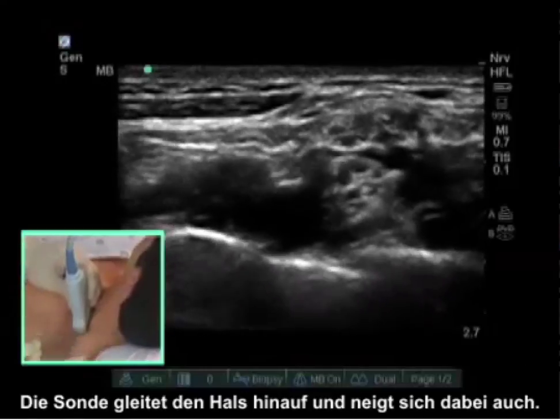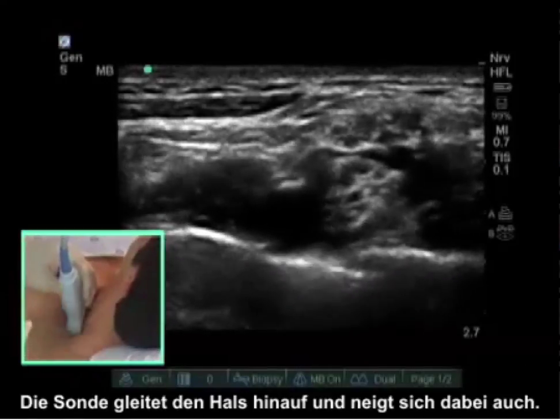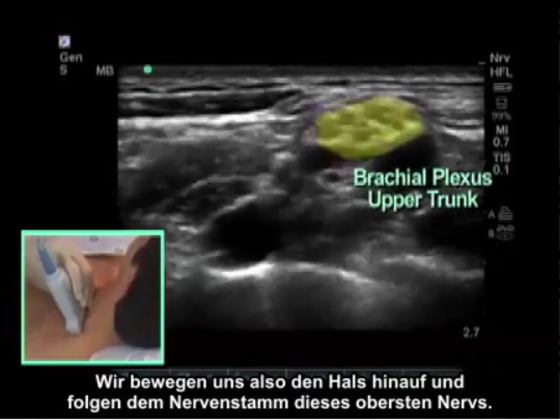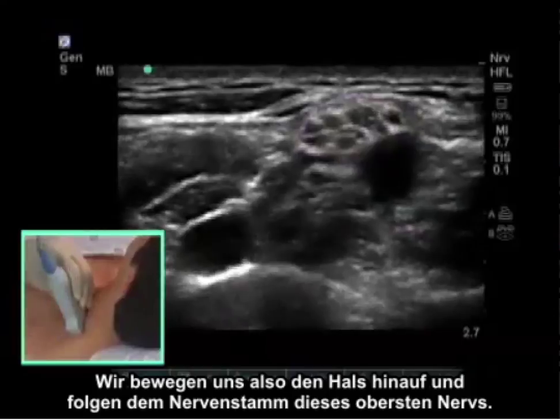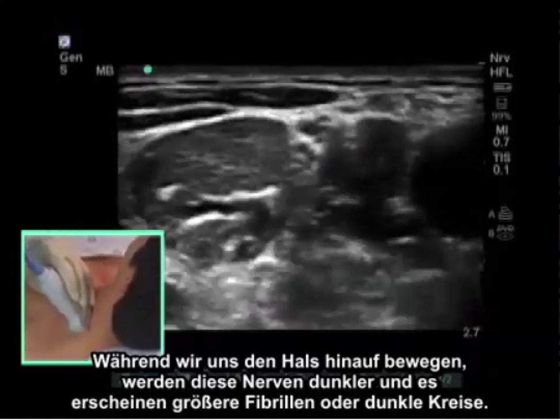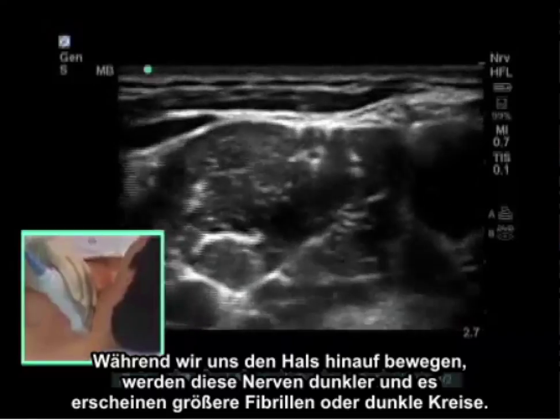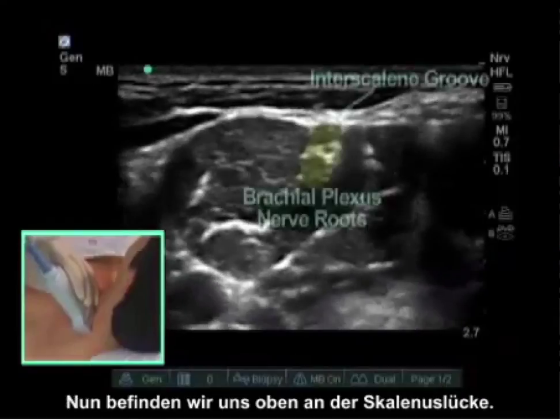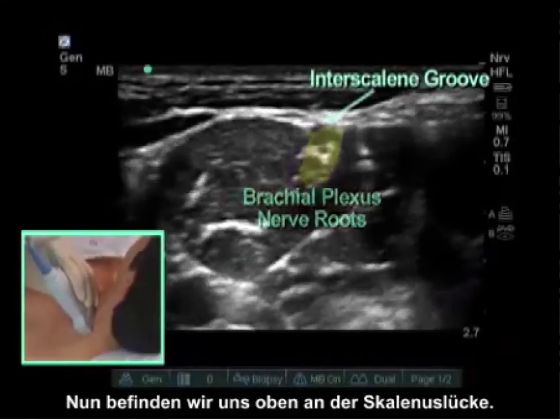The probe slides up the neck and also tilts as we move it upward. Here we are moving up the neck following the upper trunk — the most superior nerves. As we go up the neck, those nerves will become more dark with larger fascicles or dark circles. Now we are up at the interscalene groove.